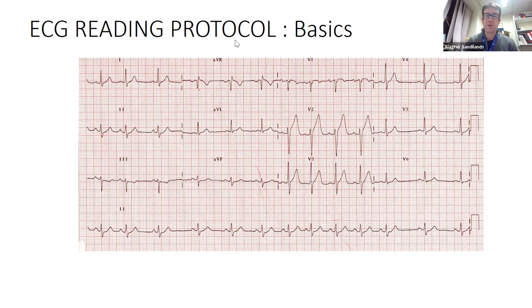I think mostly for exam purposes, you're probably going to have 12-lead ECGs. So you've got a rhythm strip on them and therefore you can count the QRSs and times it by 6, for your 10 second ECG. If you do it the other way, at the RR interval, you might get a slightly different figure because you're only taking 2 beats to make that calculation. I don't think you're going to be incorrect either way. We'd accept an answer between, for example, 70 and 80. If the students wrote that down, then that would be correct. Okay, I hope that answers your question.